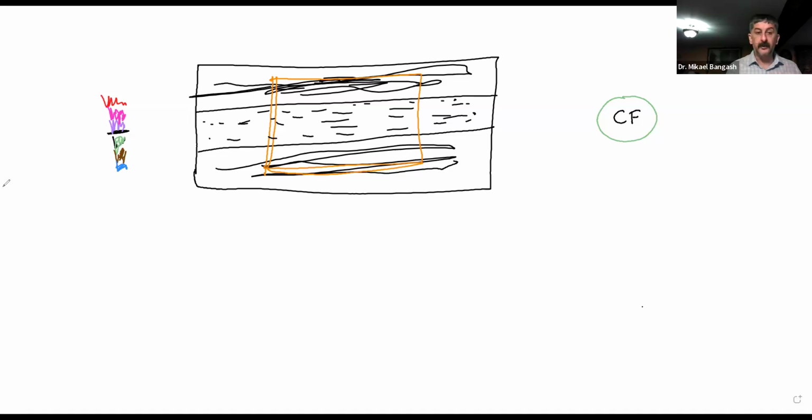Now, in this instance, the reason that we don't see a color is because of the angle between your box and the direction, either this way or this way here, that the blood was flowing.